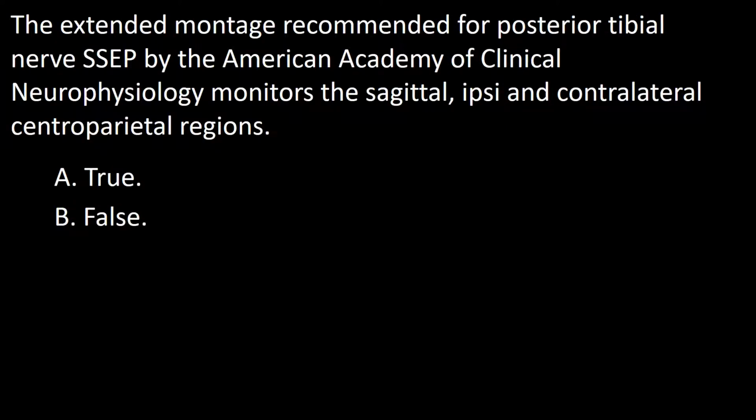Next question. The extended montage recommended for posterior tibial nerve somatosensory evoked potential by the American Academy of Clinical Neurophysiology monitors the sagittal, ipsi, and contralateral centroparietal regions. A, true; B, false.